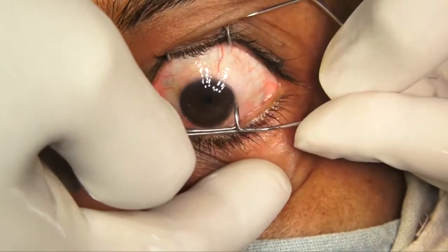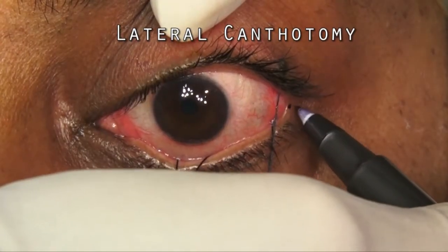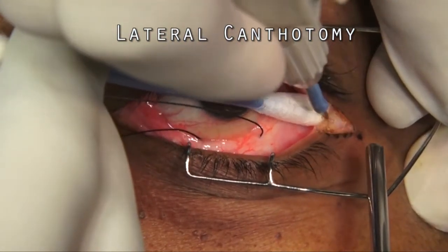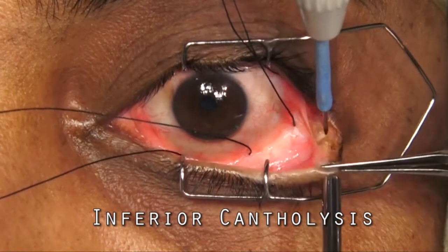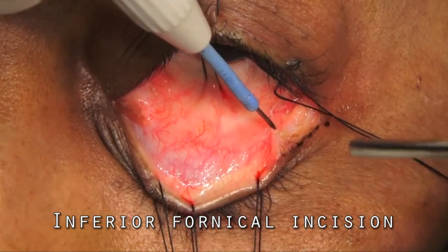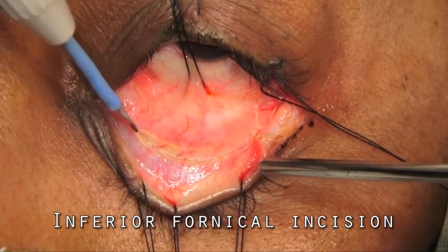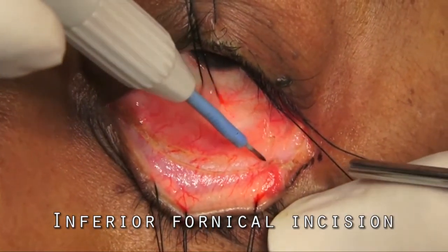The surgery is usually performed under general anesthesia. A 10 mm lateral canthotomy is marked along the relaxed tension lines and canthotomy is performed using a radiofrequency device. Inferior cantholysis is performed to provide improved exposure of the orbit. An inferior forniceal conjunctival incision is made immediately below the inferior border of the tarsus, beginning just lateral to the punctum and extending to the lateral canthus to meet the existing lateral canthotomy incision.